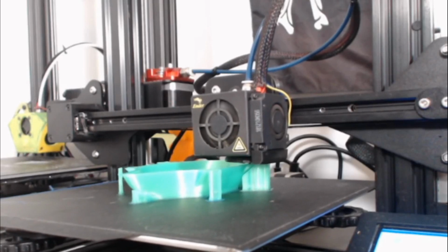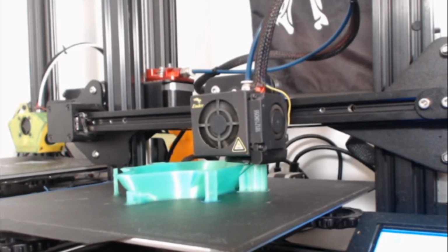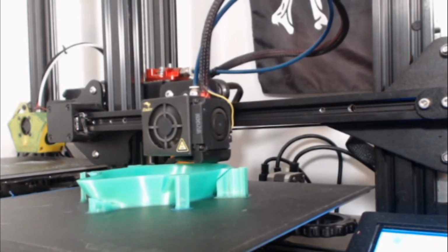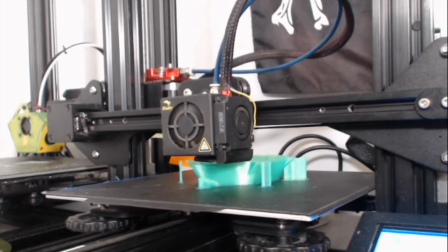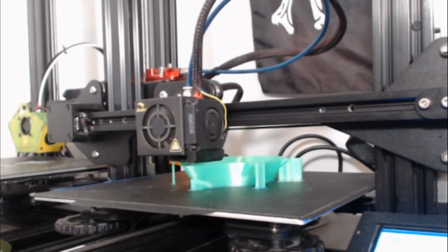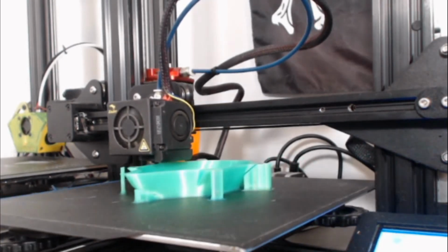But for me, as you can see here, we are well into the process of printing our second actual mask. The first mask you saw in the preview is not quite completed with finishing yet, but I wanted to show you a step-by-step of the first iteration, which was the prototype for the actual development model that I printed while I was dialing in my settings. So this is not it. This is a beautiful model with the settings all dialed in.